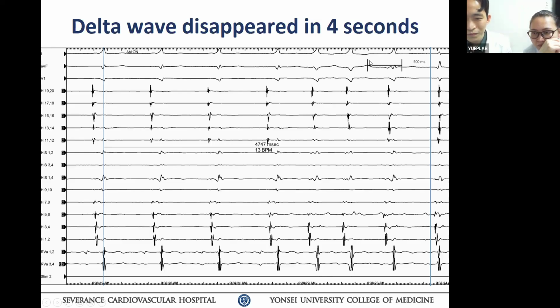Look at that. Before the block, no block yet. I have not seen the conduction block yet, but it got bigger and then suddenly slowed down, narrowed down again. So I assume that blocked the next beat. Yeah, the block, I can see a narrow complex at the very end of it. So why this automatic behavior?